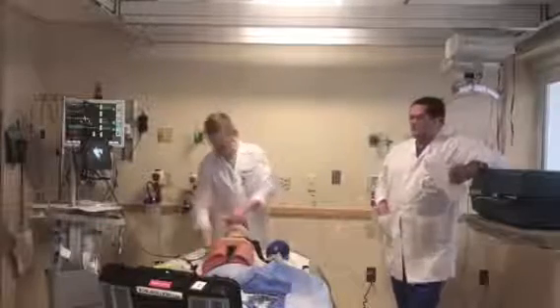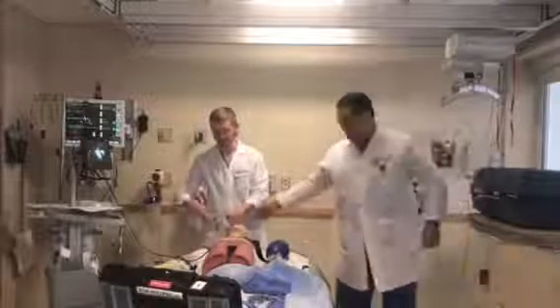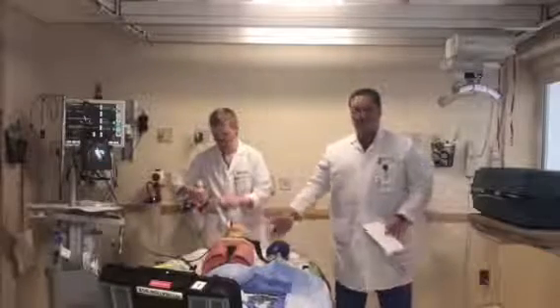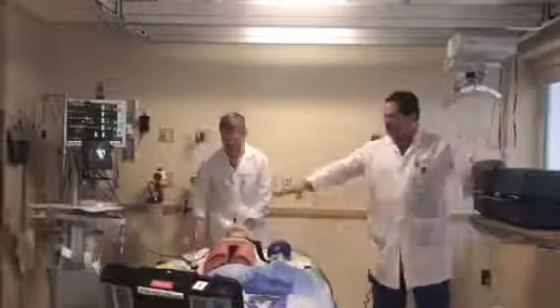So we're gonna leave this one. Back it up just a little. Pull the cuff up to 20 cc's. There's two holes, and try here again. Put one, inflate the balloon. Put the other, and inflate the balloon. You know, so it's gonna go in the larynx. Okay, that's fine. Let's assume you couldn't do it.